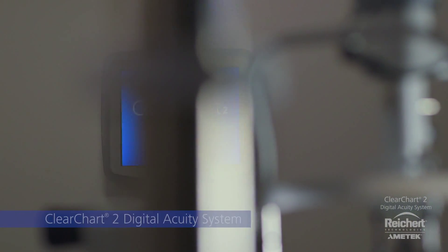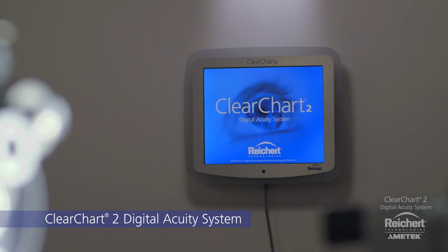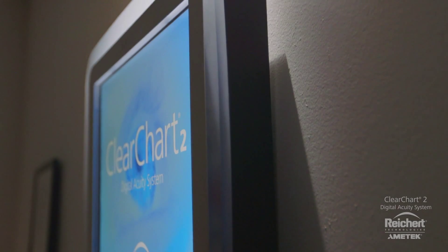Rikert's ClearChart 2 digital acuity system is an all-in-one system designed from the ground up for all of your acuity testing needs. The slim profile design is elegant and built to last, and it's easy to set up and use. Just hang, plug, and refract.